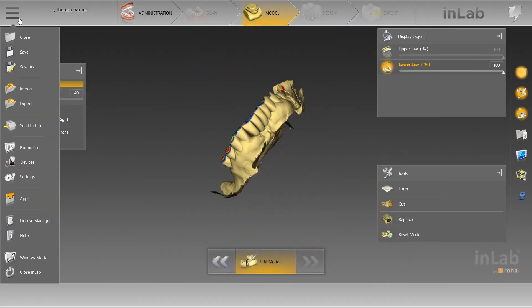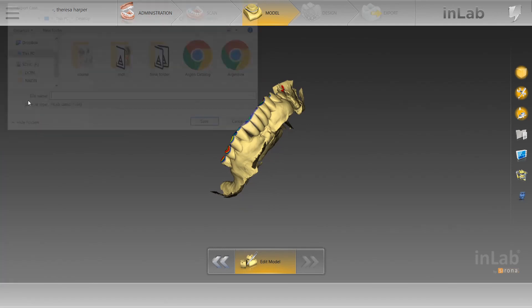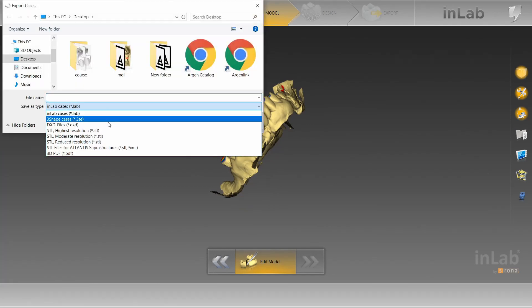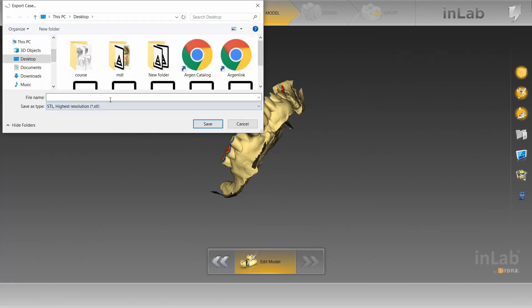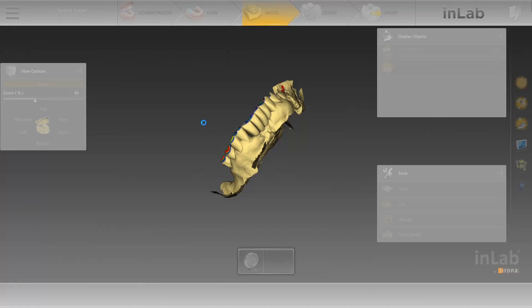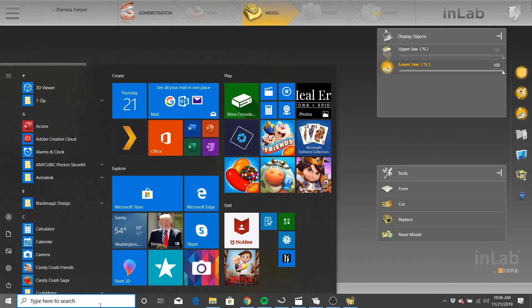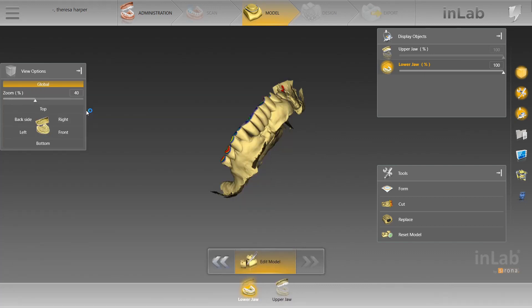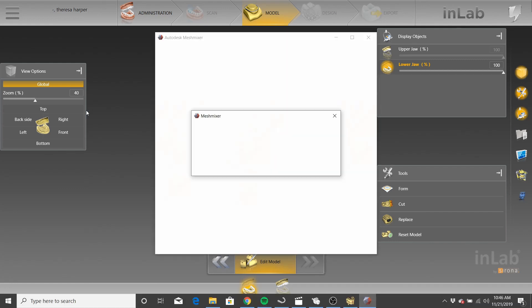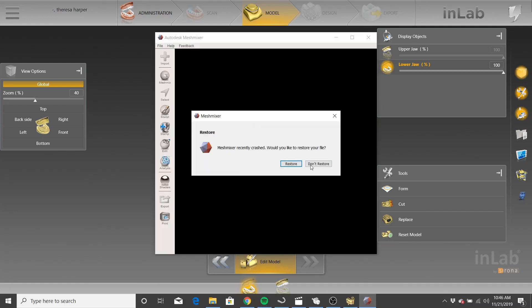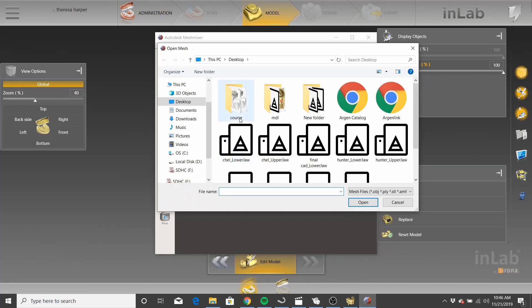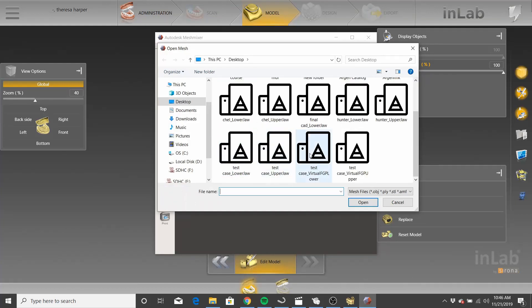You're going to go back into in-lab. You're going to, instead of going into the model module, you're going to go to export. Let's export this as an STL file. We'll call it test case. Save. Then we're going to go to mesh mixer. We're going to open up mesh mixer. Mix up some meshes. Don't restore. We're going to import. Let's go to our test. We've got our test file now.